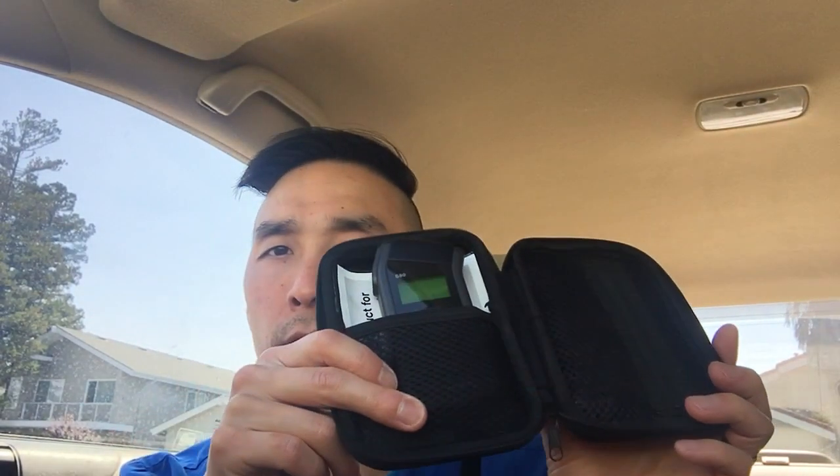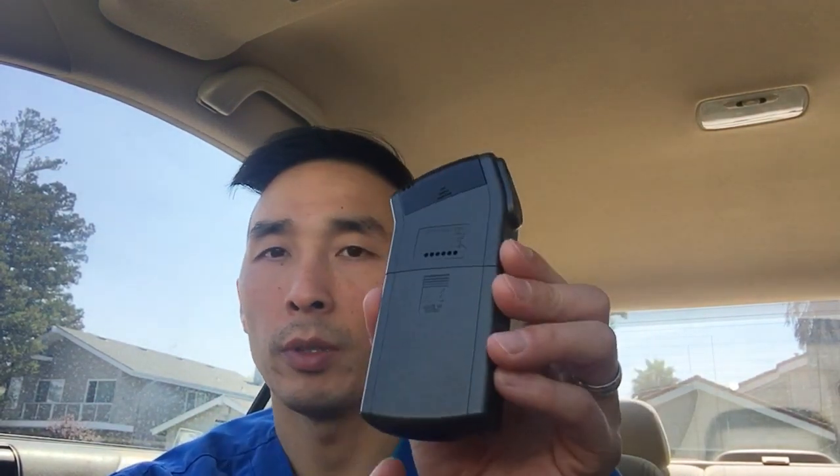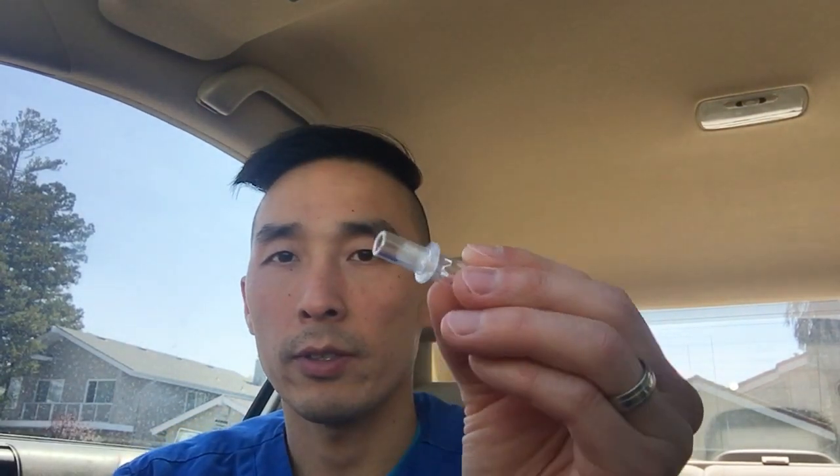Let me pull it out for you. It comes in a little case like this, and here it is in all its glory. It's not too big, so that's not bad. You put the batteries right here — two double-A's right there. To be safe, I like to always keep a couple of extra batteries inside. It also comes with six mouthpieces that look just like this — you just put one in like this.